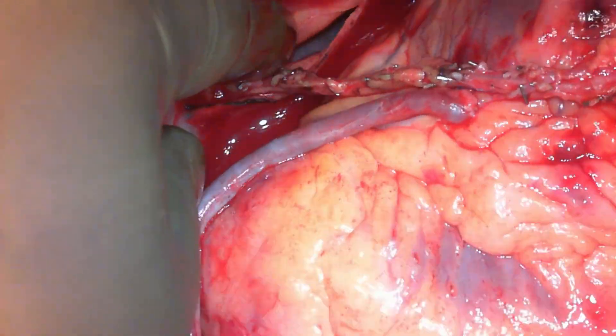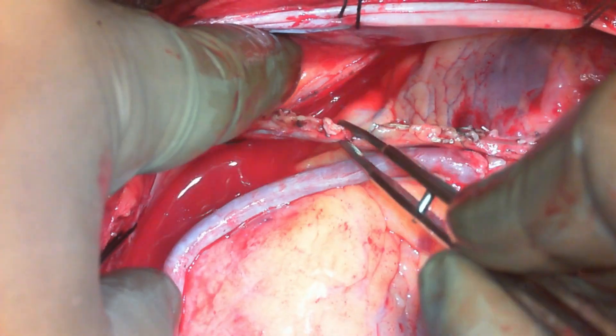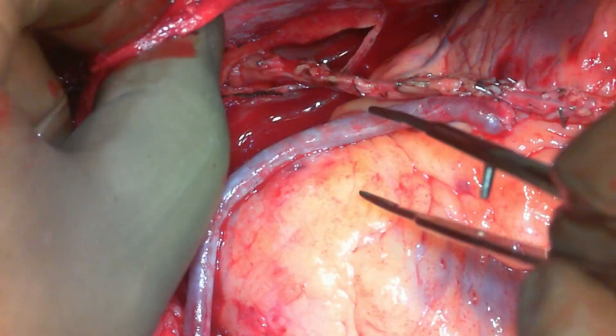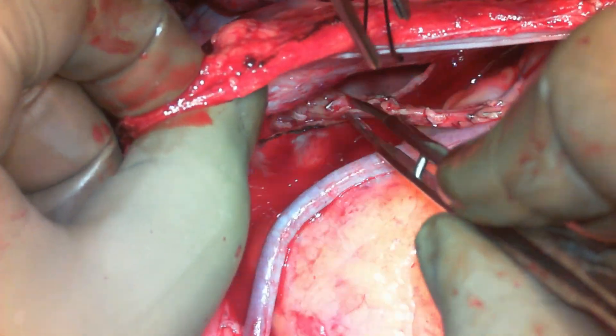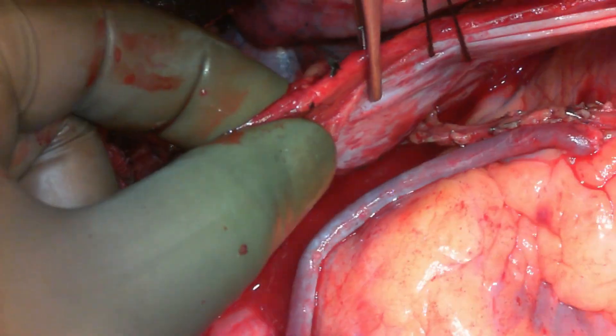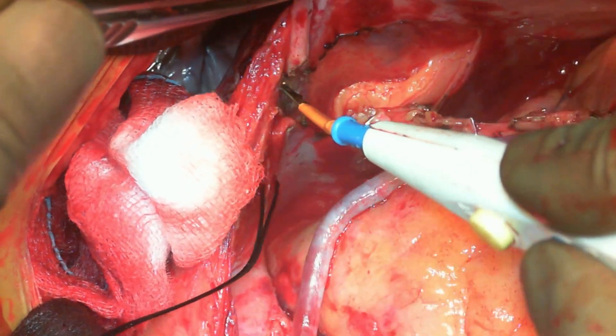If the mammary is lying loose and looking good, one can leave it at this stage. If you still have some doubt and think the mammary needs more room or length, one can divide the pericardium.